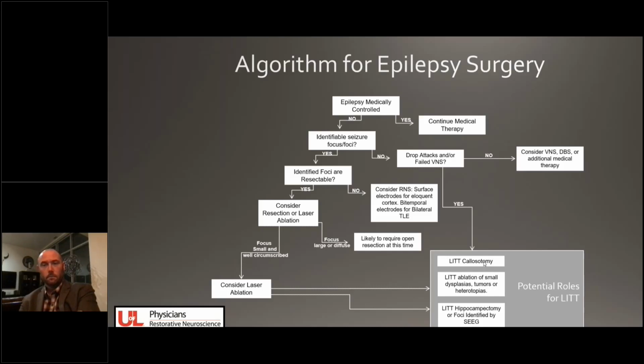The effect of that callosotomy is extremely complete. We did a 2/3 anterior callosotomy. We did it in two trajectories, one coming from the parietal lobe and crossing obliquely across the corpus callosum, and then the other treating the rostrum of the corpus callosum.